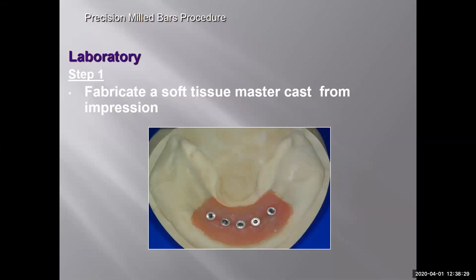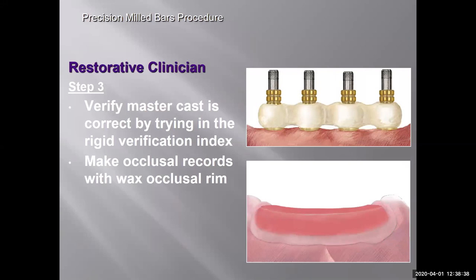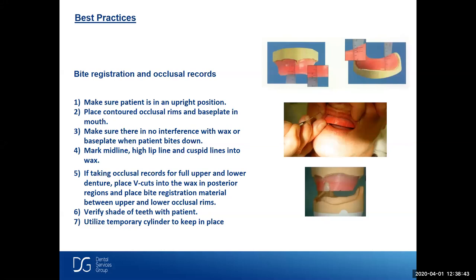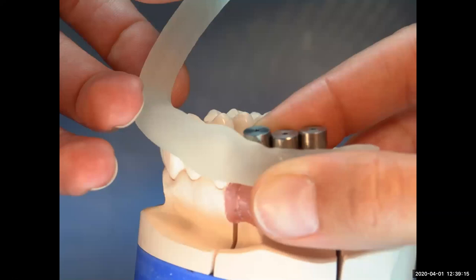To review: first fabricate a soft tissue master cast from the impression, make the verification index, then take the occlusal rim. Verify the cast is correct and take occlusal records — for an upper we need midline, cuspid line, high lip line, and smile line. Utilize temporary cylinders to keep the bite registration in place. The Primatex splint material is excellent for verification indexes because of minimal shrinkage and expansion. Wrap it around temporary cylinders, put it in the light cure unit for about three minutes, and you have your verification index.